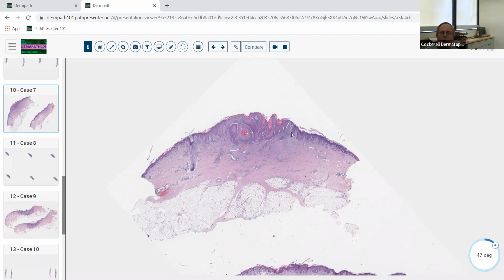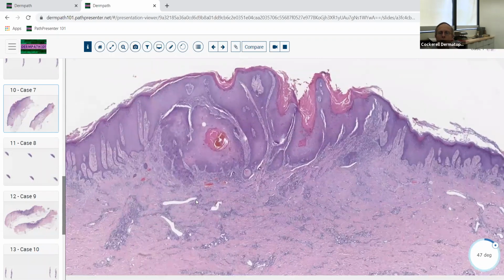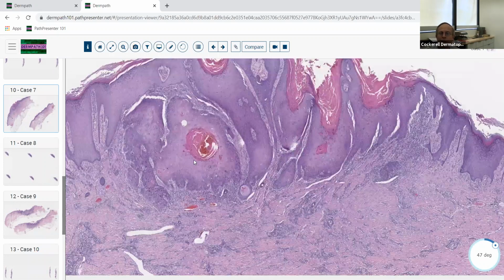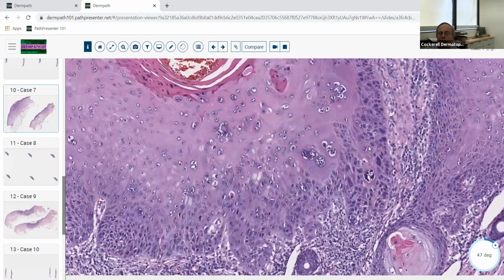Now, we also have keratoacanthoma, and this is an example of one of those. There are several different subtypes of keratoacanthomas. This probably would have been a really small lesion that's almost warty in its appearance. But notice that it's got the exoendophytic morphology. It's got the central crater. This may be a little bit off to the side of the central crater, but it's got these bulbous, irregular aggregations of keratinocytes. And you usually in a KA will get some keratinocytic atypia.